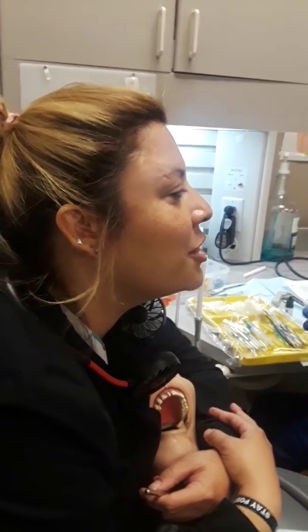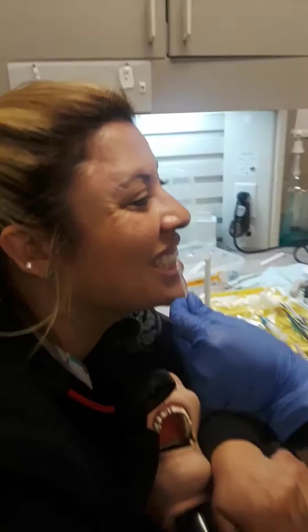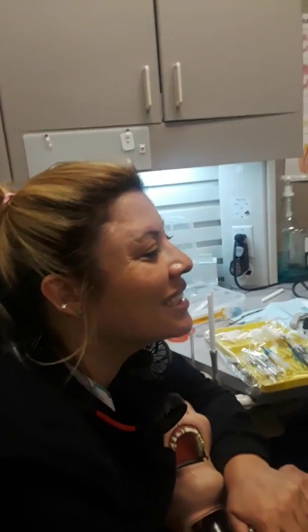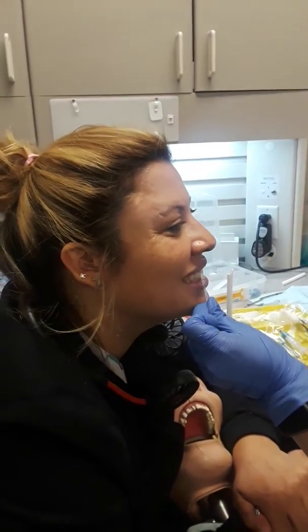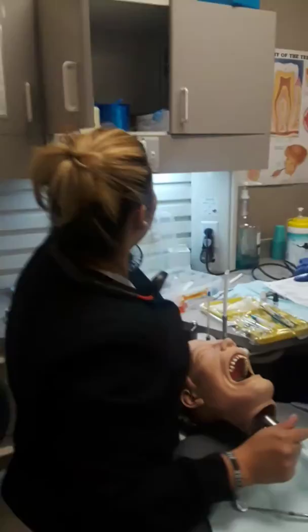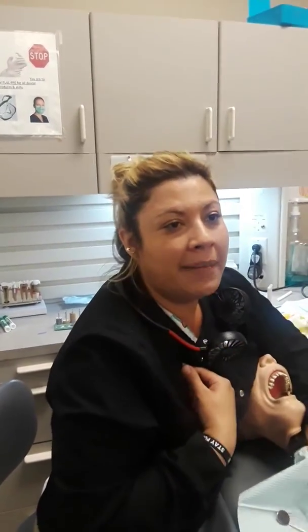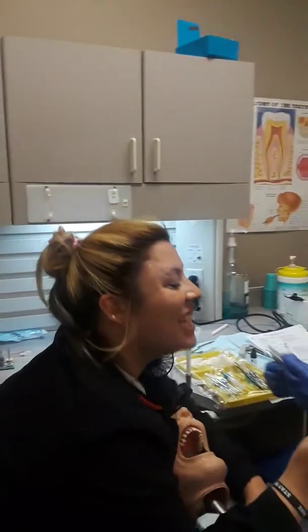If you have a cross between two shades, that's when you pull out the mirror and ask the patient. She's going to cover the letters on the shade tabs because the letters don't matter — she'll just say 'this is your first shade, second shade, third shade — which one do you like better?' Here's your first shade.